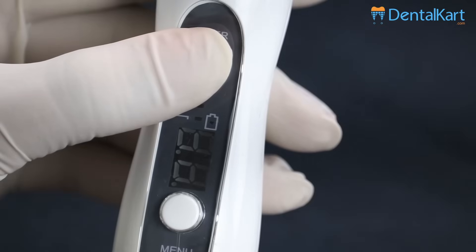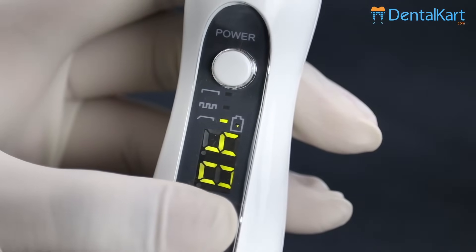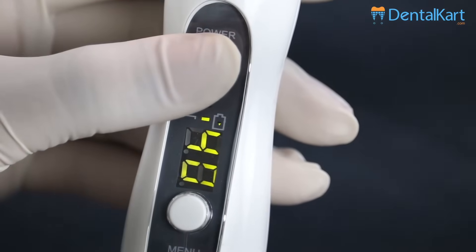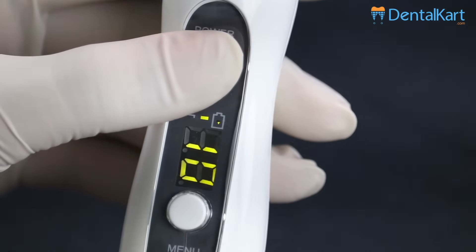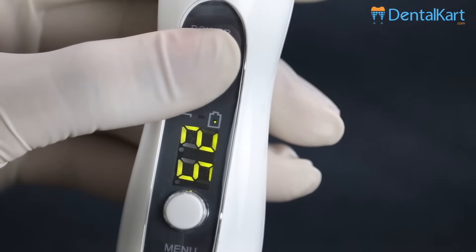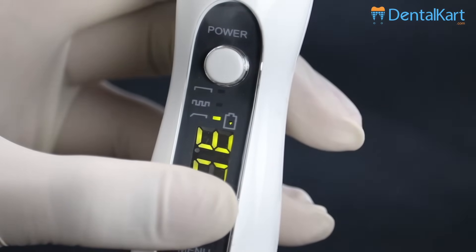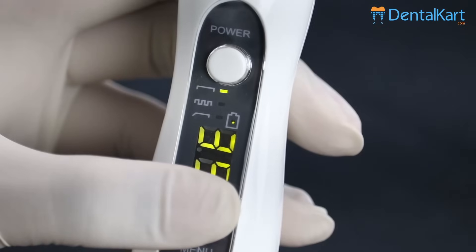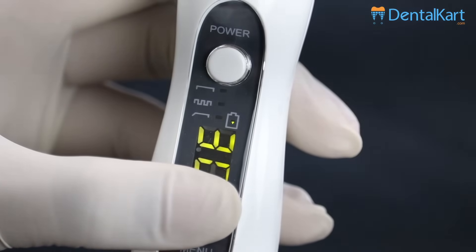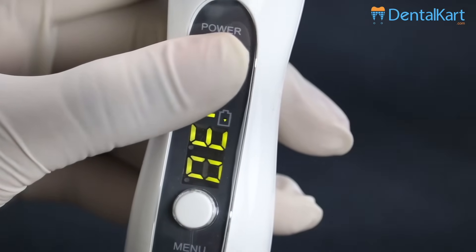Press the power button on. Press the menu button for a while. After you hear the sound, press the power button again to adjust the timer between 5 to 40 seconds as per your requirement. Again press the menu button to adjust the operating mode — strong mode, flashing mode, or gradually strong mode. Again press the power button to start using the device.